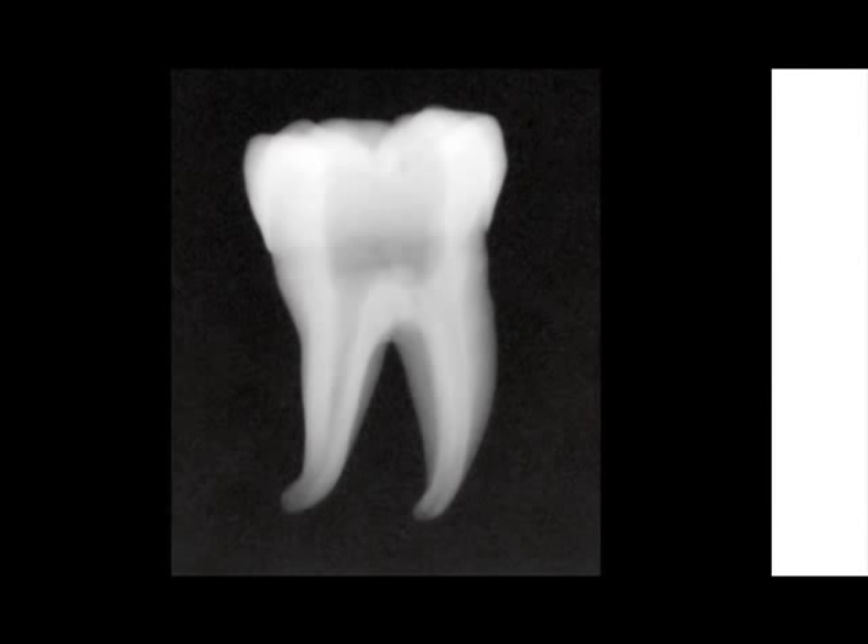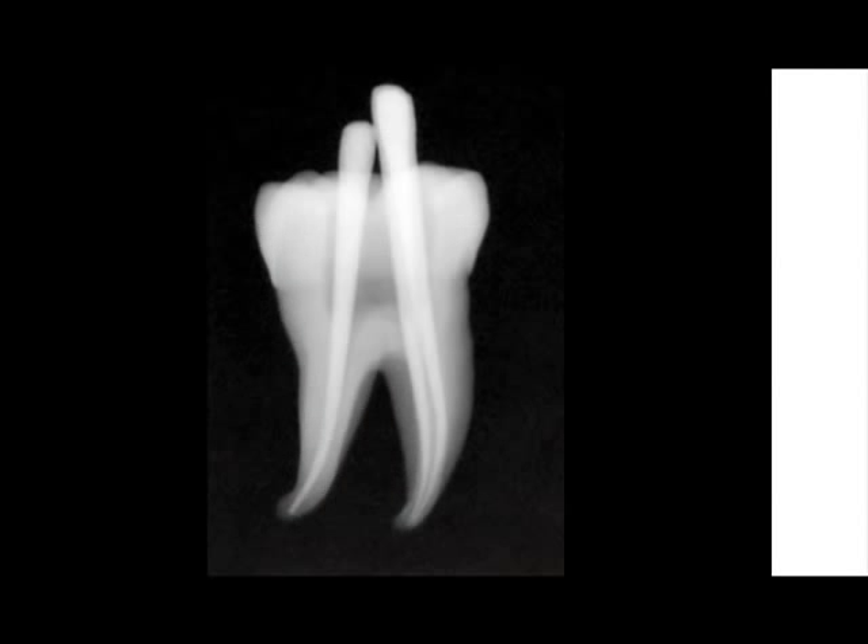We are going to show two different epoxy cement preparations in the obturation of a mandibular molar and a maxillary bicuspid. Here the canals have been shaped and the medium gutta-percha points are trial seated in the canals. They all have significant tugback.